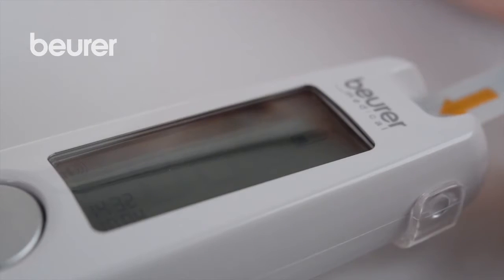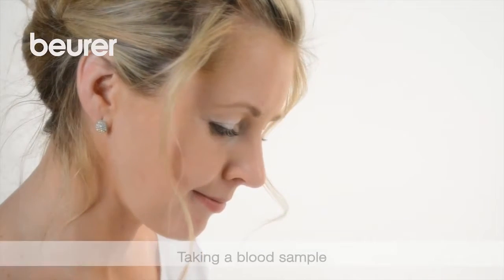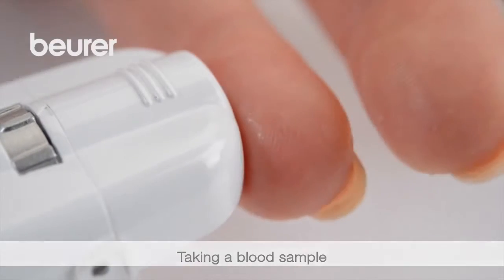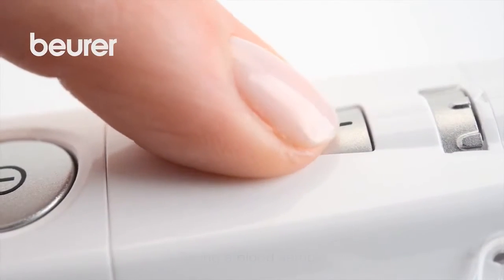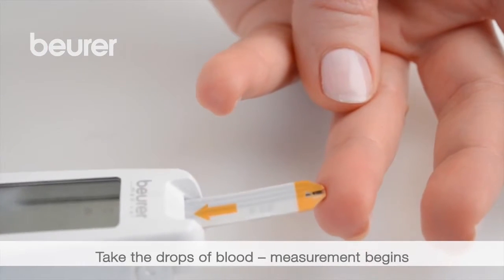The device switches on and is ready for measurement as soon as the test strip symbol and the droplet symbol appear. Your hands must be clean and dry. Position the lancing device and press the trigger. Completely fill the input gap with the drops of blood.